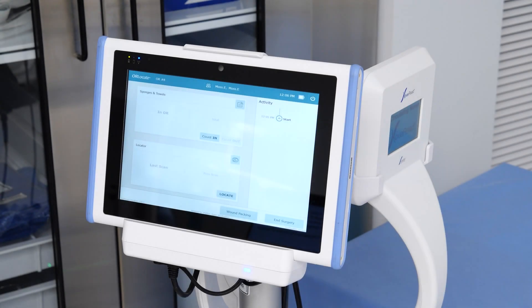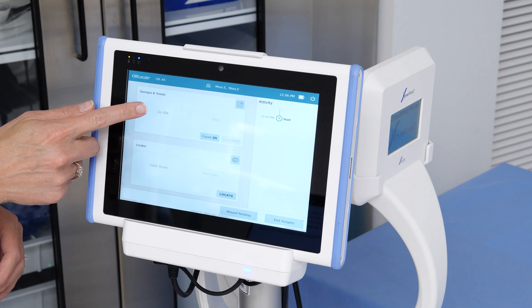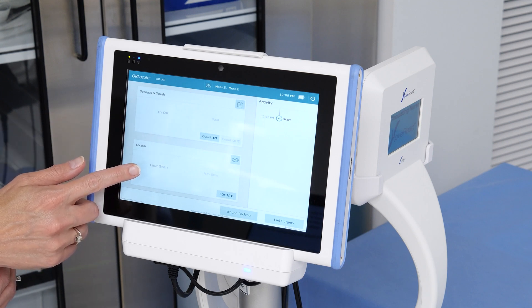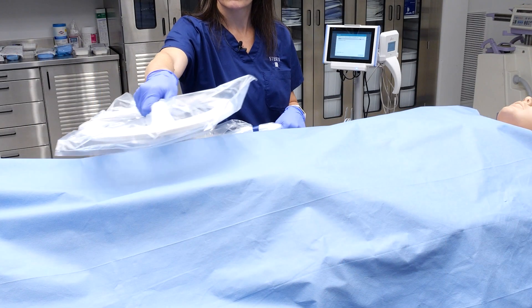To begin a surgical case, you will see the main user interface on the display. The window at the top-left corner of the display supports the counting in and out of sponges from the surgical case. If a missing sponge or towel occurs, the window in the lower left corner will be used to initiate the locator wand and identify any missing RFID-tagged sponge or towels found.